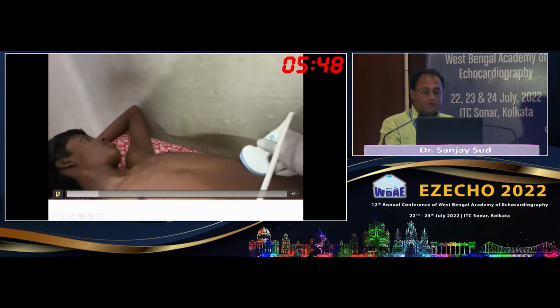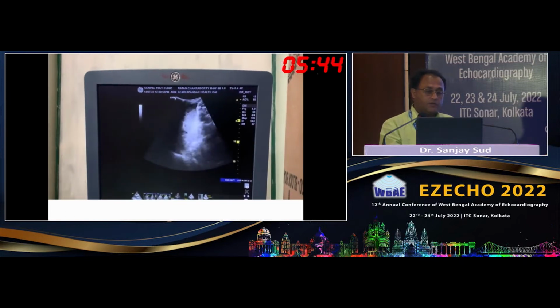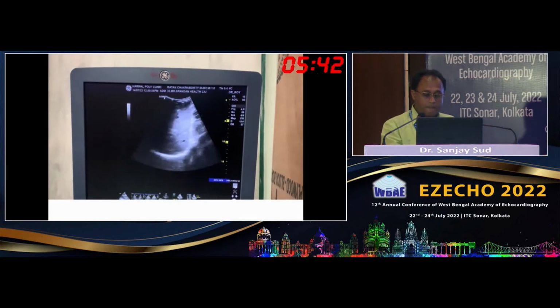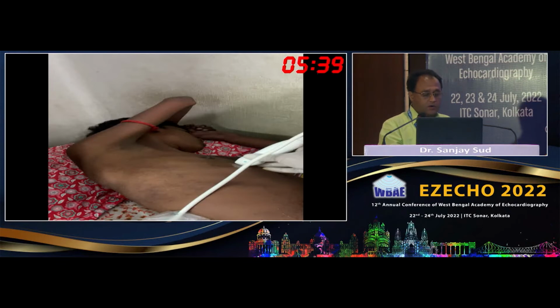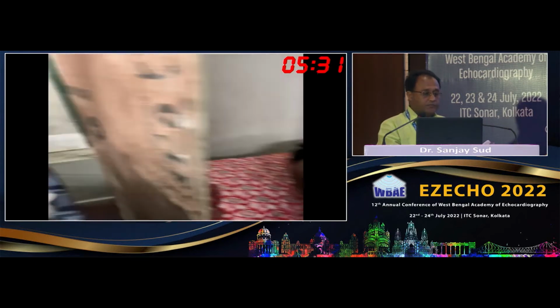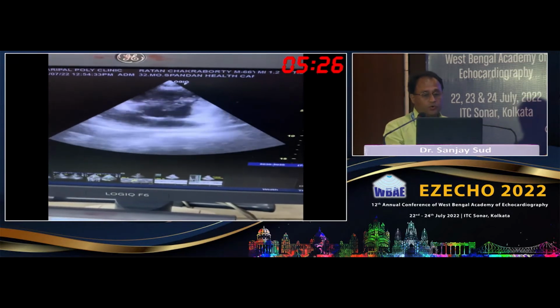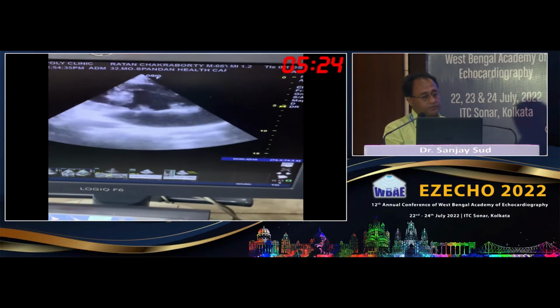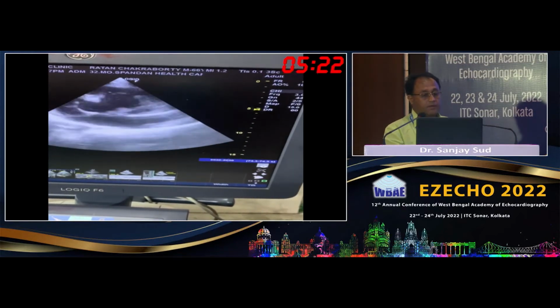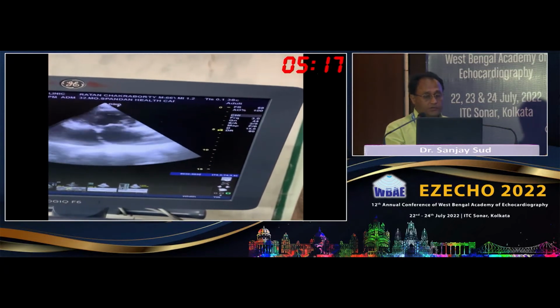Here, with the abdominal probe, to find out, the liver is seen here on the left side. Some background noises might be there, I'm sorry for that. And the anatomy, the first time when I made the patient lie down, the anatomy was totally disrupted. It was very difficult for me, first being a situs inversus, and then this totally disrupted anatomy.